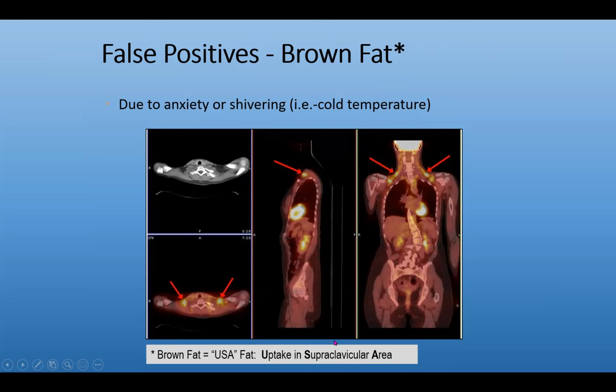Just to note that brown fat is also known as USA fat, and that's not a slur on the Americans being overweight. It stands for uptake in the supraclavicular area. Okay, so USA fat or brown fat, referring to the same phenomenon.